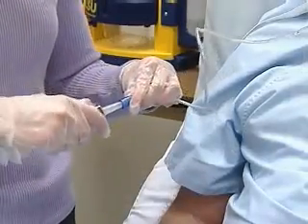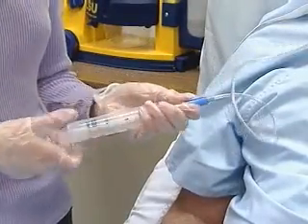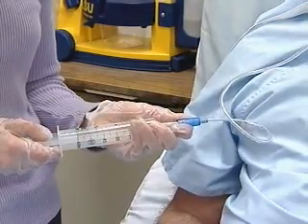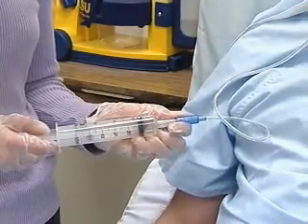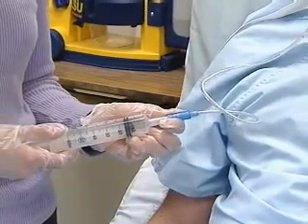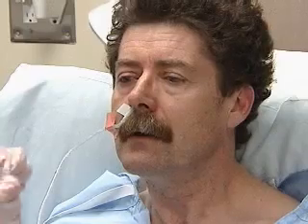You'll attach the distal end of the tube to the syringe. Aspirate gently to obtain gastric contents. You'll observe these are usually cloudy and greenish, but they could also be off-white, tan, bloody, or brown.